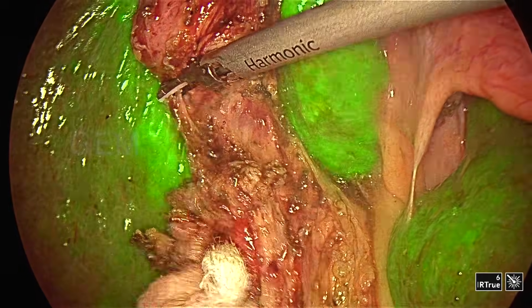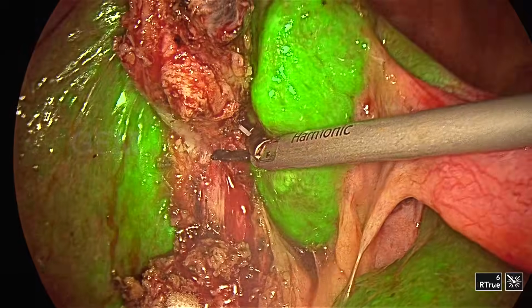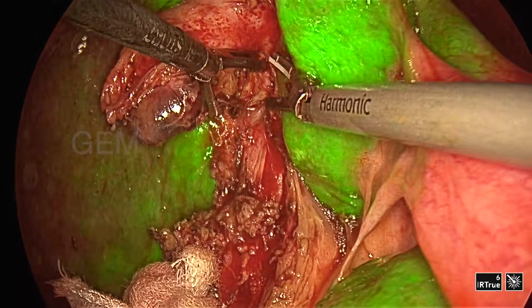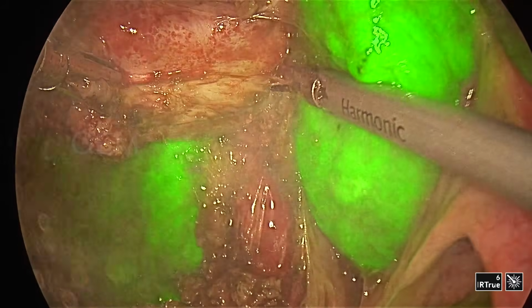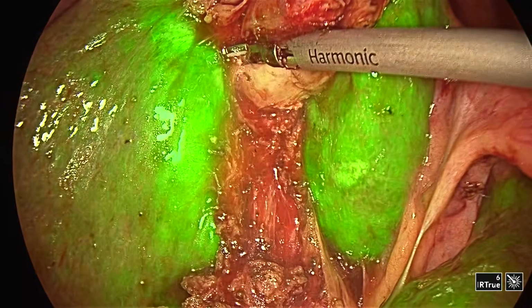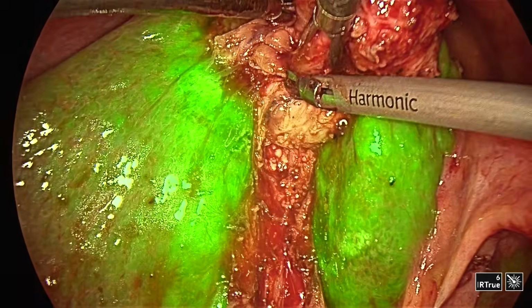So when you are having ICG, use it in this type of cases. Always when you are doing a gallbladder, don't give ICG on the day of surgery. You have to give it the previous day night, so that only the liver and bile will be stained, and all the vessels will have the ICG washed out. So 1 hour before, 3 hours before, it's not good. Before minimum 6 hours. So the previous day night is the ideal one.